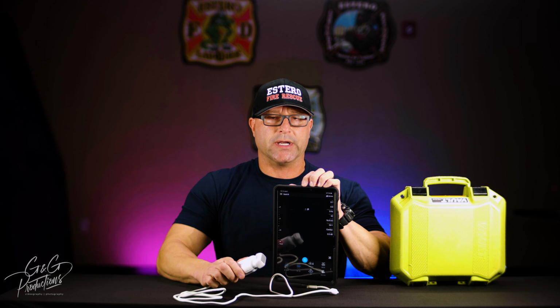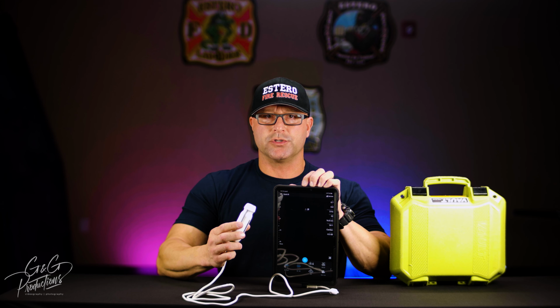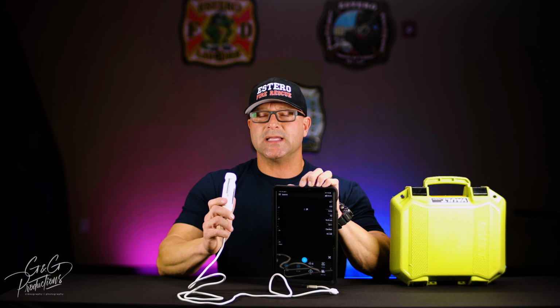So you have to make sure that the probe is in the correct orientation, or else you won't get the image you're looking for, or you get an image that doesn't make any sense, right? So that's why you have to make sure that the probe marker is in its correct placement as well as the transducer. Here at EFR, we're going to be doing 2 different types of exams for now anyway. Eventually we'll reach the full potential of this thing and all the things that it's able to do and see, and it's really, really cool.